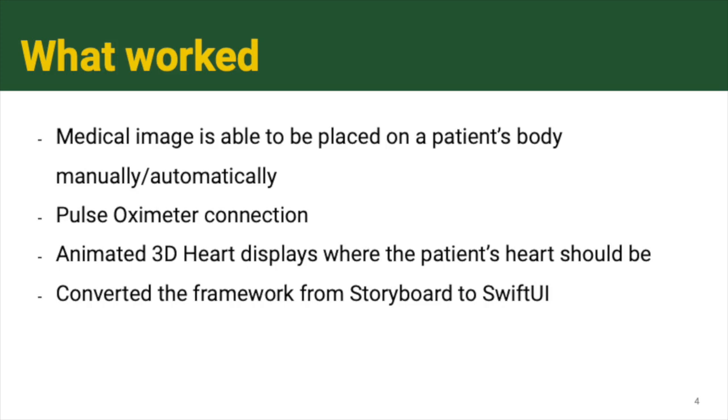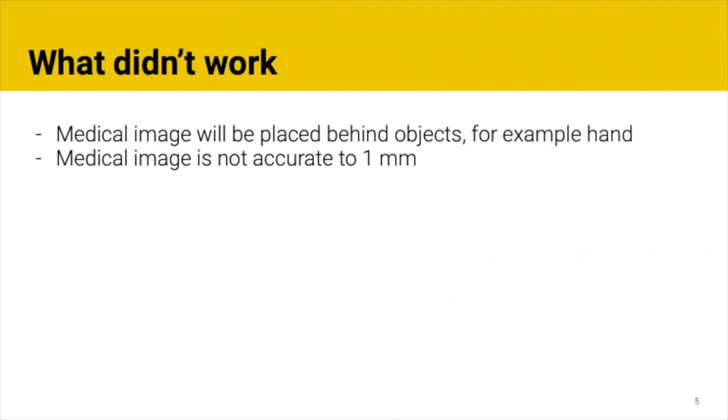Thirdly, by utilizing the values from the pulse oximeter, additionally with body tracking from ARKit, we were able to process these values to display a 3D heart image on top of the patient's body. As with many software projects, the importance of software maintainability is one of our priorities. Therefore, the code has been converted from the legacy storyboard framework to a more modern SwiftUI framework, thus allowing the lifespan of the software portion of the project to be more future-proofed.